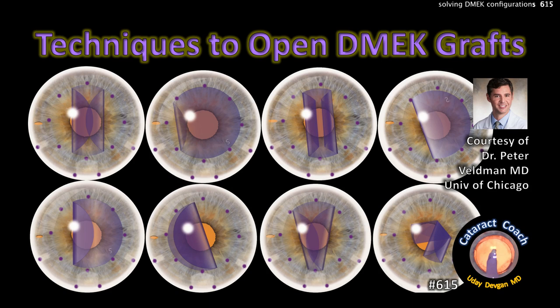CataractCoach.com — techniques to open DMEK grafts, courtesy of Dr. Peter Veldman from the University of Chicago.